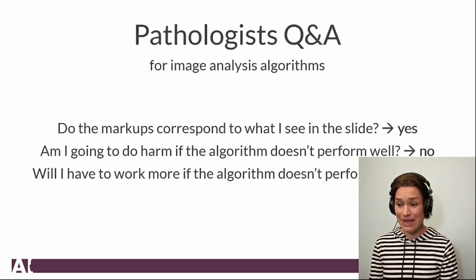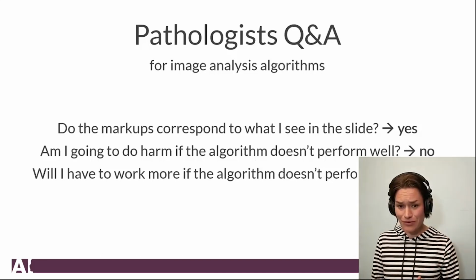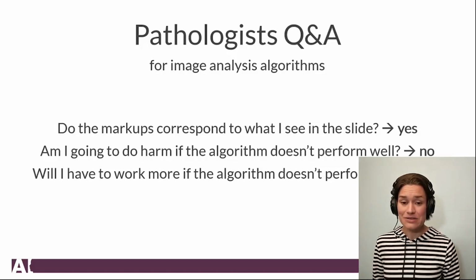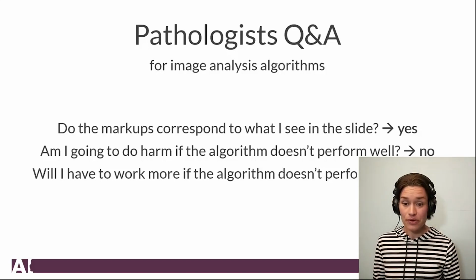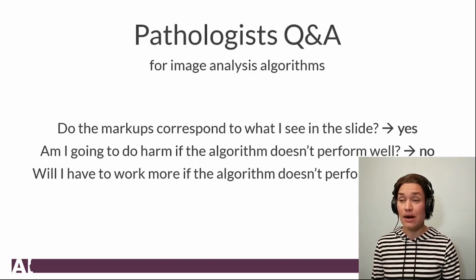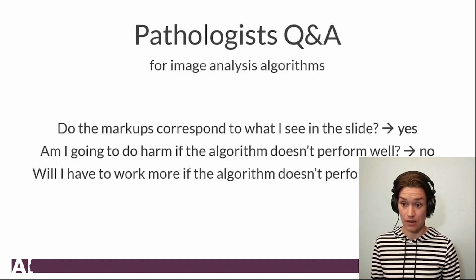But if there are too many of those false positives, then you have to do more work than you would have to do otherwise. So again, this is no magic tool. You always ask yourself, is it worth using this tool? What is the barrier to developing it, and what can the damages be if it doesn't perform well? So that guides the metrics as well.